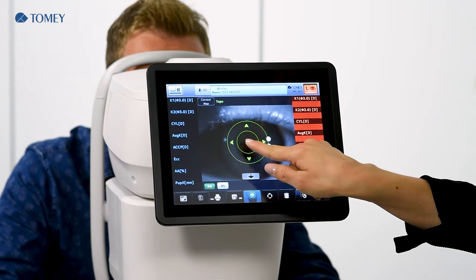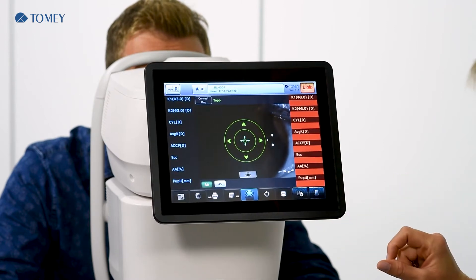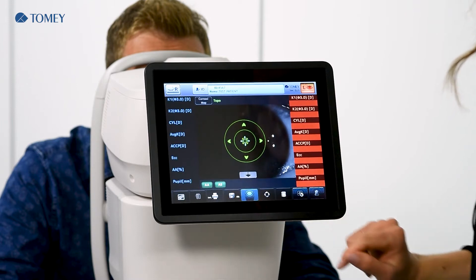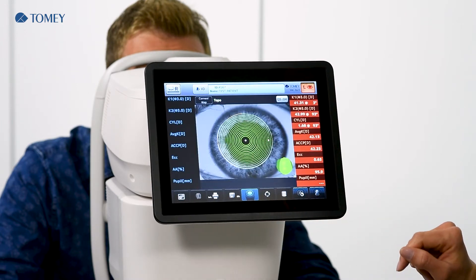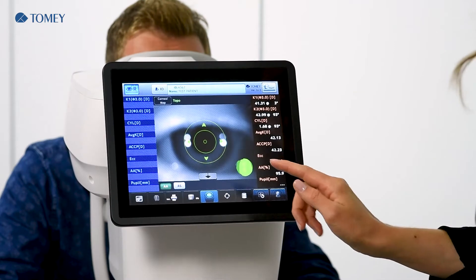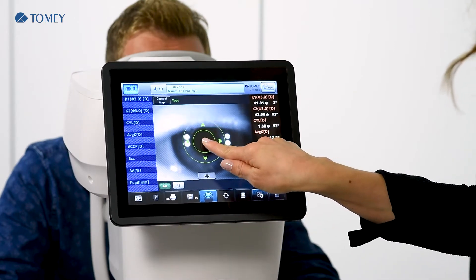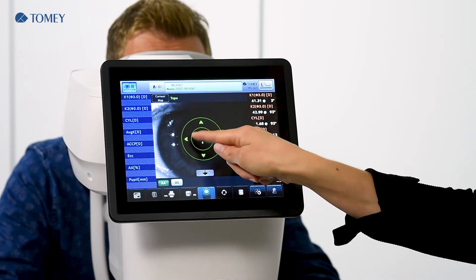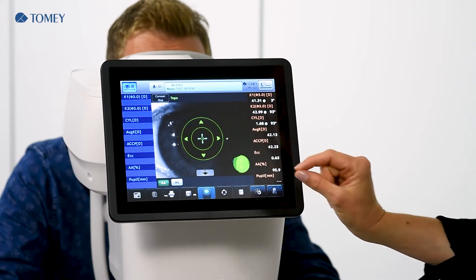Let's get into the focus. Now please blink one time and open. Left eye is done. We go to the right eye and get again into the focus. You see when the device is in focus on the blue cross, which is on the pupil.